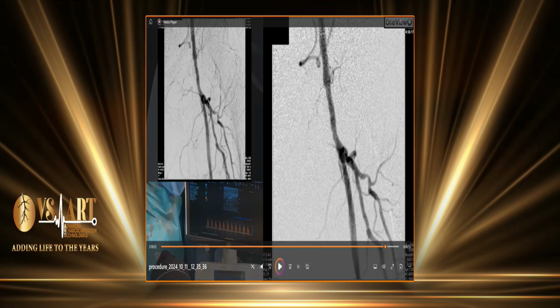What do you think? For me it's good. I think it's excellent, Marc. It's an excellent hemodynamic and angiographic result, and for the clinical result also. Okay. Thank you, Marc. Thank you. Bye.